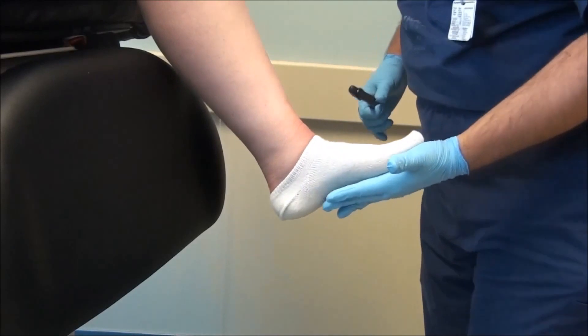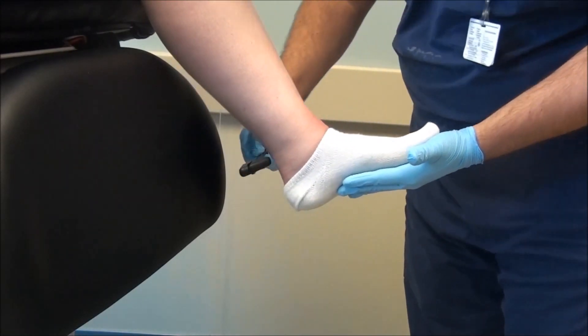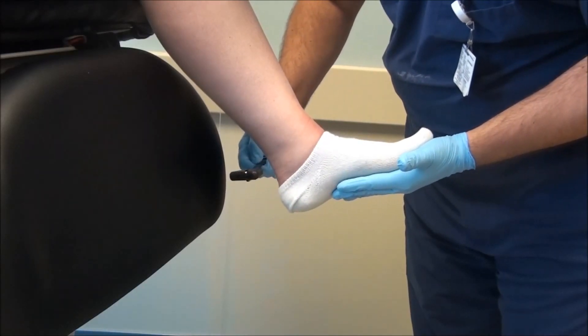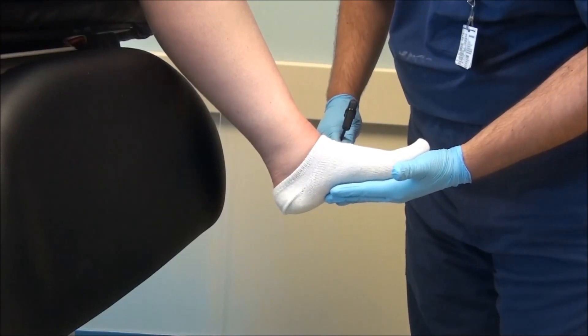First, put the ankle and foot into a neutral position. Then, using a standard reflex hammer, tap over the Achilles tendon. What you'll see is a small dipping downward in a plantar flexed position.